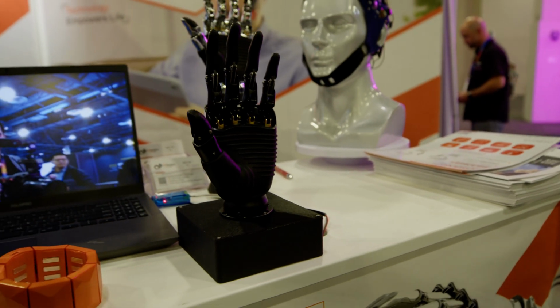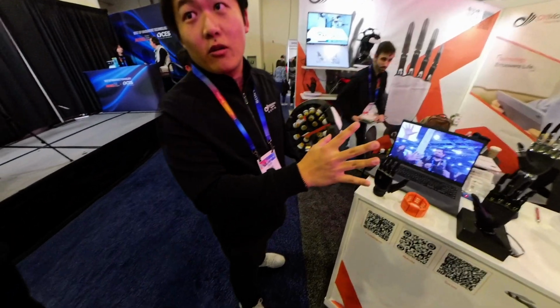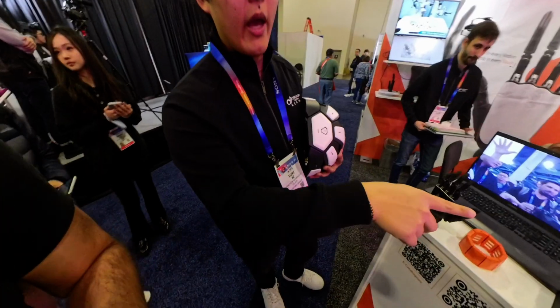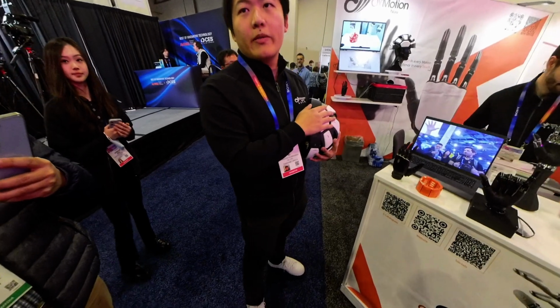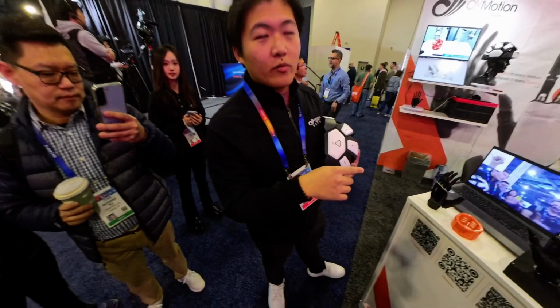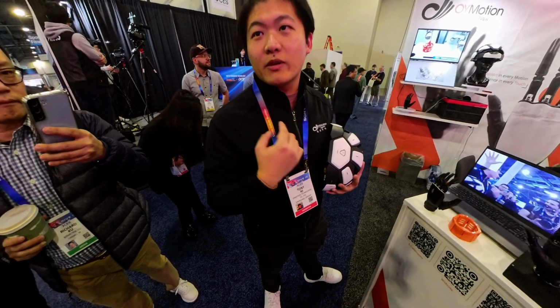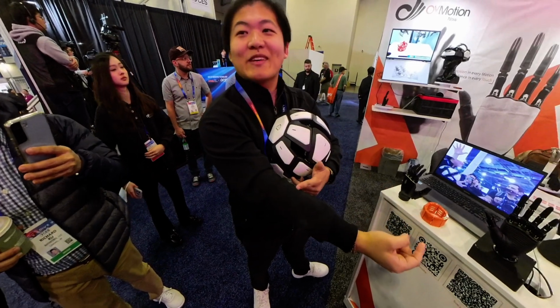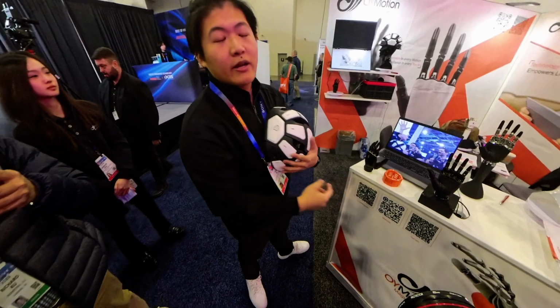These hands are rated to carry over 30 kilograms each, so they're pretty strong. And the hand controls video, but will the head be able to control? You can control the hand using any control source you want. It is a bit hard, because another big reason why we don't use the head for amputees to control is that over here the data is a lot more encoded compared to over here, where intention is a lot easier to detect and understand.